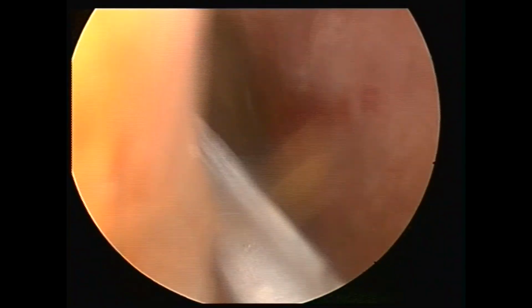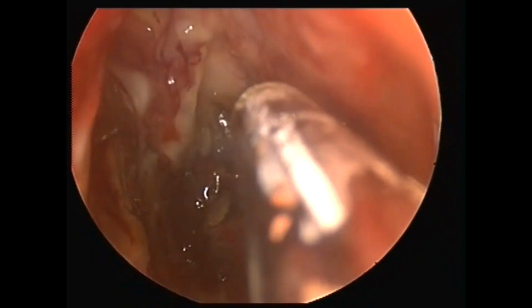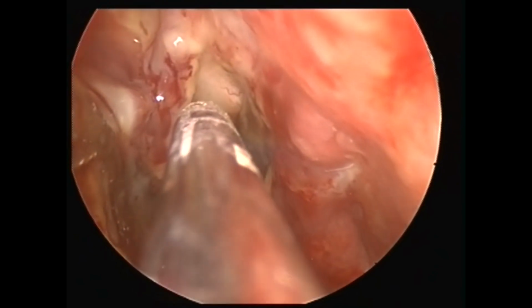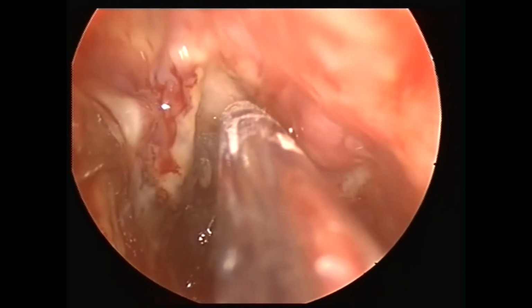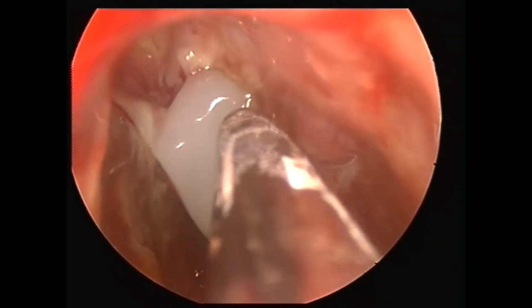And whatever scab you can see lying there on the skull base, I'm going to keep it that way and I'm going to keep giving multiple liquid paraffin nasal washes. So once I'm done with my endoscopic nasal wash and I'm satisfied that the patient is free of all the fungus and the debris, I'm going to put a lot of steroidal ointment inside with the help of a 20 cc syringe and a suction cannula. So you can see I'm trying to put Neosporin H ointment, that is an antibiotic as well as a steroidal ointment. So keep the patient on oral steroid tablets at a tapering dose.